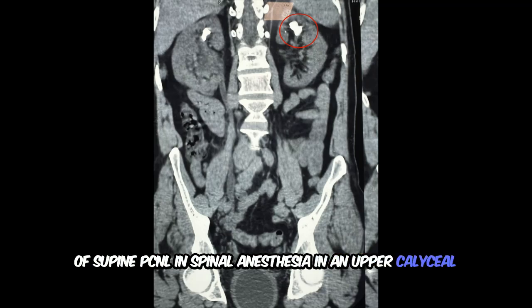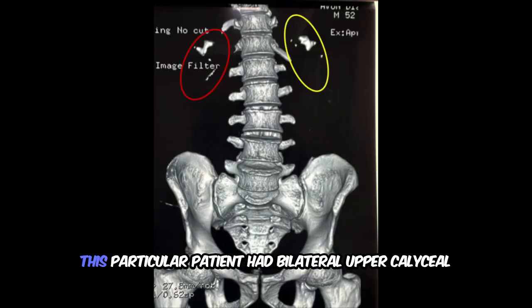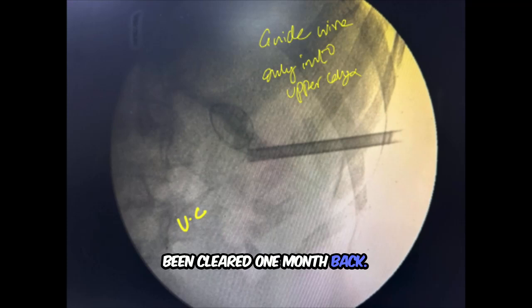In this video, I want to discuss the feasibility of supine PCNL in spinal anesthesia in an upper calyceal stone, which is looking like a diverticular stone. This particular patient had bilateral upper calyceal stones. The right stone burden had been cleared 1 month back.